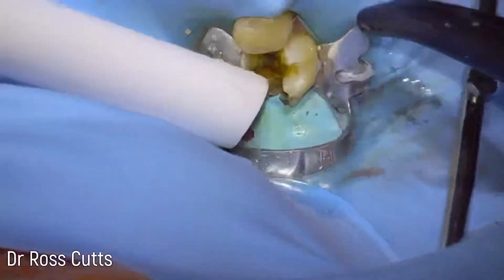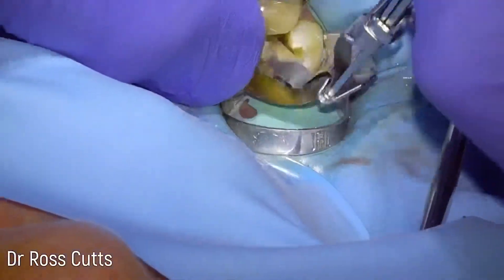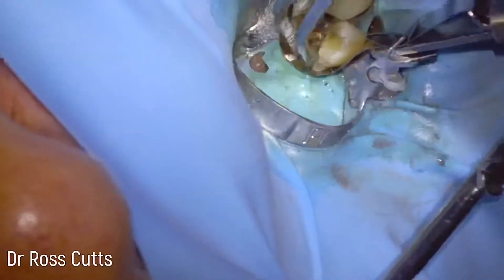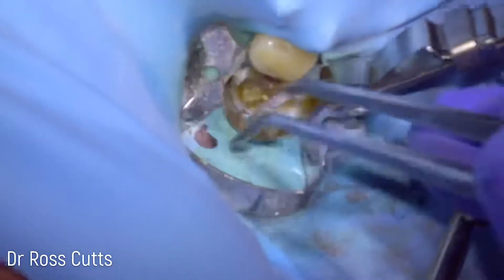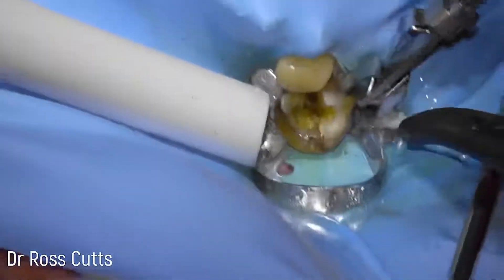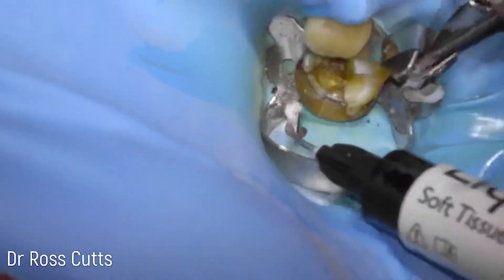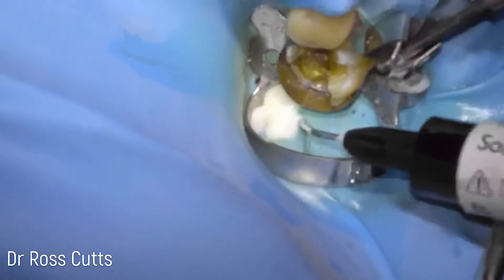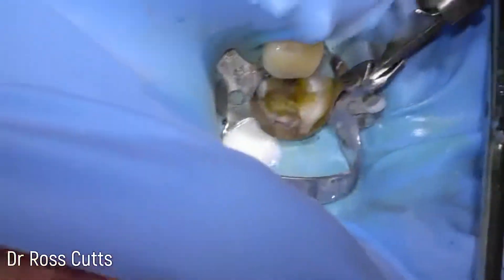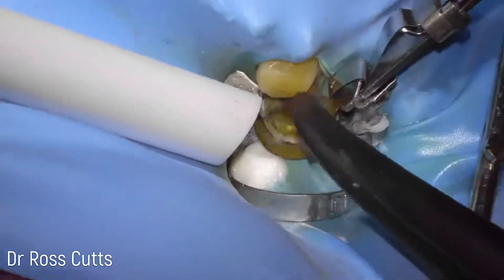Sometimes the little rubber dam can tear and get shredded, so we just put a little sectional band on to help shape the tooth. There are different types of bands — this is another example of what I'm comfortable with. We use something called liquid dam where we can repair the rubber dam to recreate our moisture sealant, and after drying the tooth we can see we've got a nice clean tooth surface.